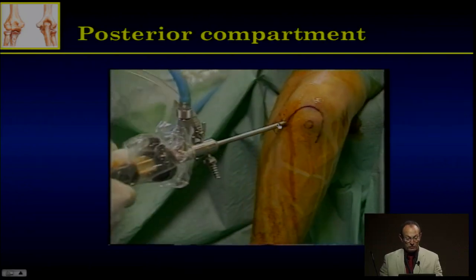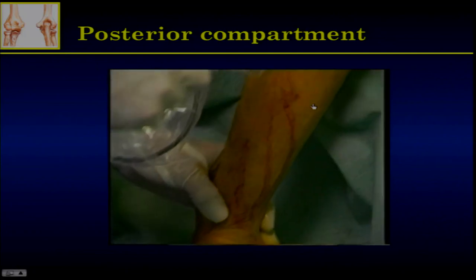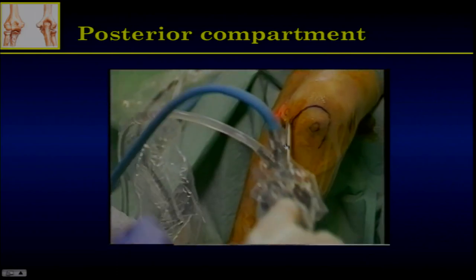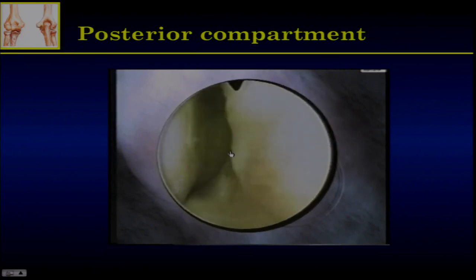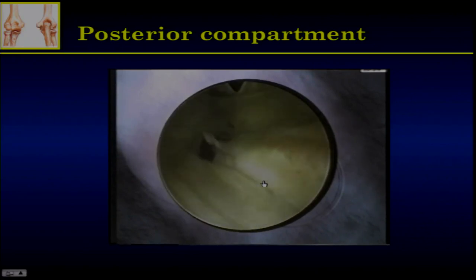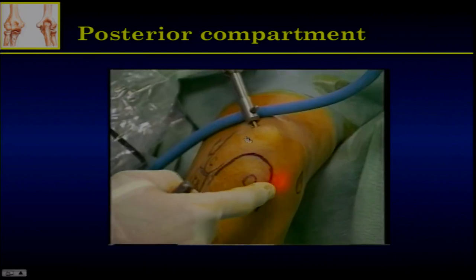Here is a sample. The scope is in the posterior portal. There is always a fat pad at the triangle — you can remove it using the other portal with a shaver. By pivoting the wrist and forearm, you can see the radial head, the capitulum, and the ulna. Going to the lateral aspect of the radial head, you can see the annular ligament and the capitulum. Following the lateral gutters, you can see the olecranon on the right and the trochlea on the left. There is always a bare area without cartilage at the junction between the horizontal and vertical planes of the olecranon — it's not arthritis, it's normal.